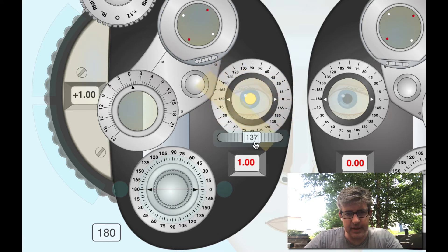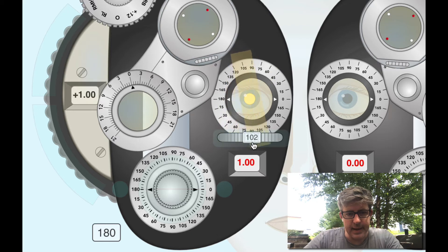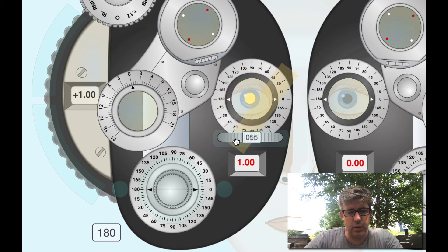This looks good. This one's going to be pretty easy, maybe I should re-record this just to do a tougher one. Yeah, so spinning around I think I'm neutral at every angle. So I think we have a good result.